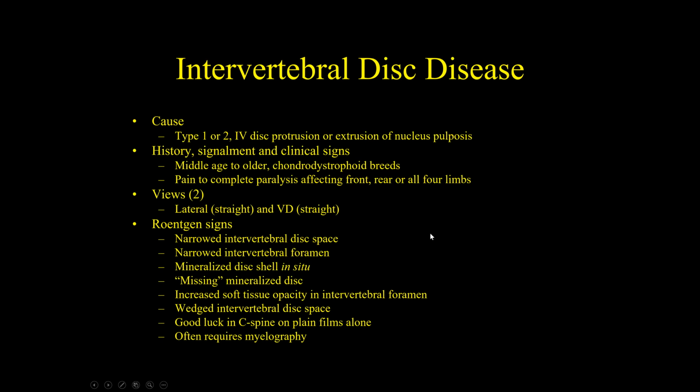So radiographically, typically you get plain films of those regions. Again, you try to avoid whole body dogograms, even if it's a small breed dog. And so if you think he's got neck pain and a cervical lesion, we would probably want to center the films over the neck, not the TL junction. If he's got lumbar pain, we would want to center the films over the lumbar spine, okay? It makes sense, but you'd be surprised how many people just shoot a whole body radiograph hoping they see something. And usually it's a non-diagnostic film that way.